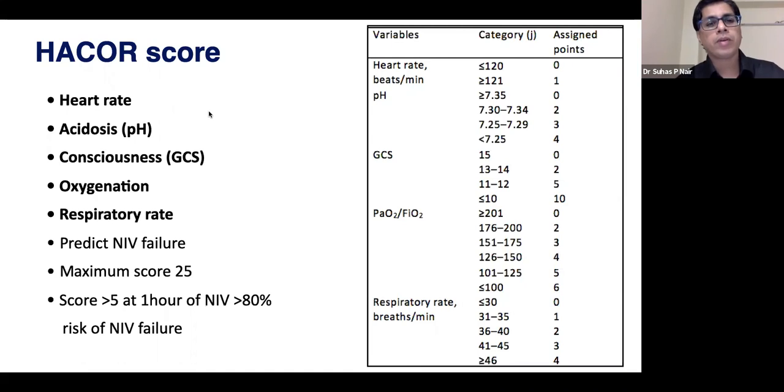The most important thing as a respiratory physician or intensivist is that a patient on NIV should be in front of you, or there should be a trained person to watch for NIV failure, and you should pick up the patients who are failing on NIV and proceed to invasive ventilation. Roughly speaking, a patient who is becoming more tachypneic, desaturating on NIV, and requiring an FiO2 of more than 60 or 70 is not going to hold too long on NIV. Proceed with invasive mechanical ventilation; that will improve the chance of survival.